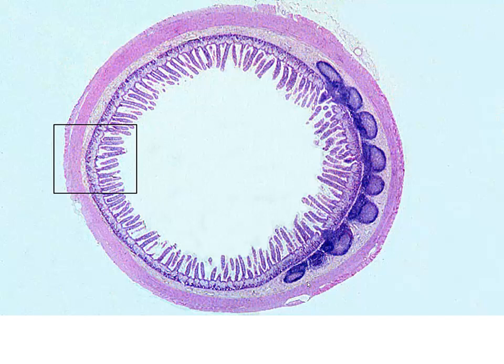Now, the striking feature in this particular field are our Peyer's patches, we can see our secondary lymphoid nodules aggregated together here in the submucosa, and that's our first indication that we are looking at ileum. Then we look at our thin, slender villi. That's going to be another indication that we're looking in ileum. As we look at these closer, we're going to see an increasing number of goblet cells, and altogether speaks to the fact that we're in the ileum portion of the small intestine.